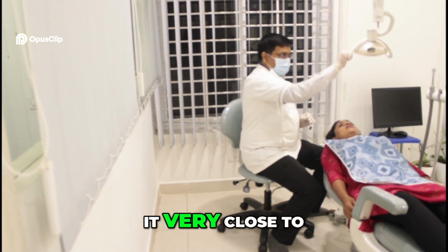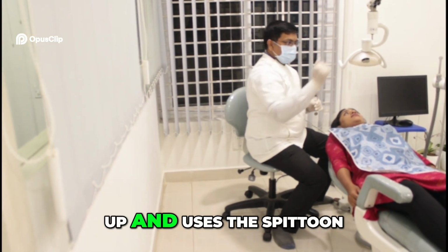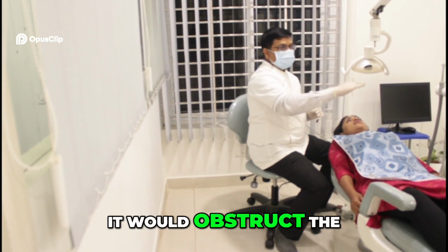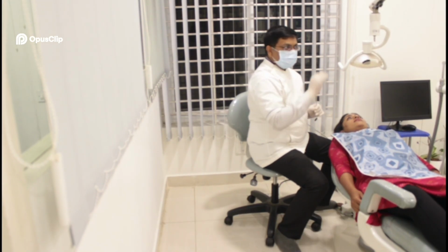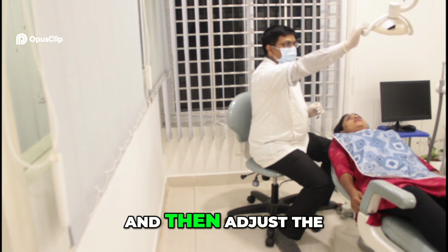Let's say I keep it very close to the patient. Let's say the patient gets up and uses the spittoon to rinse the mouth. It would obstruct the movement of the patient. Likewise, it may even obstruct the movement of the operator. So, it's safer to keep it at one arm distance and then adjust the light.